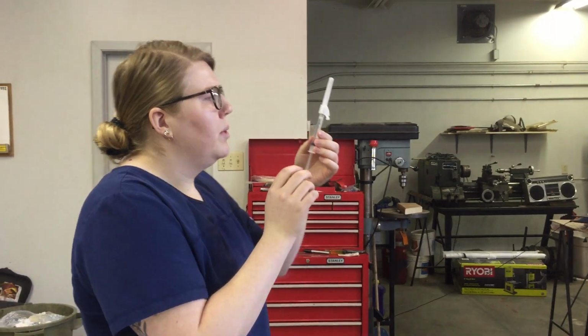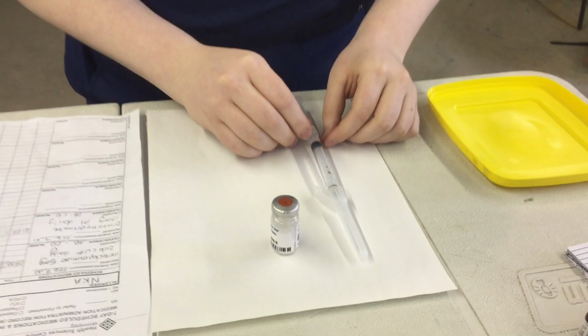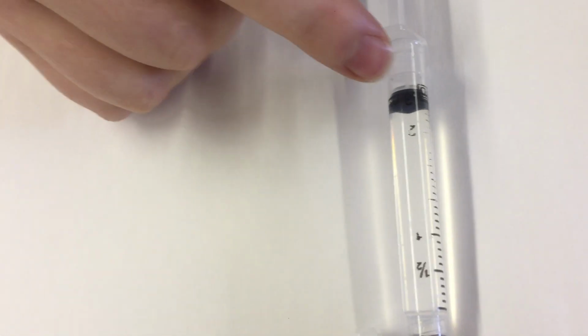Okay, so now that I know that we don't have any bubbles and this is the correct dose, I'm just going to put this down so my photographer can look at the right, go this side too. So this is the 3 here and then the line to make sure.